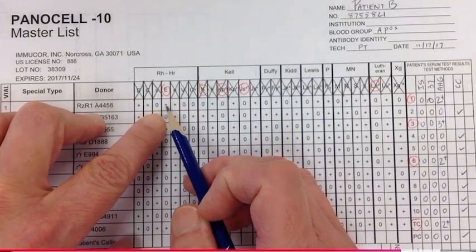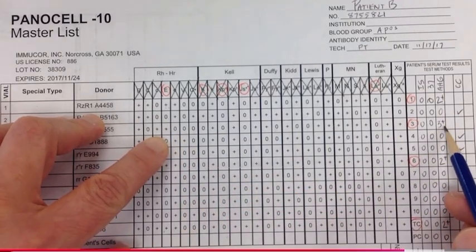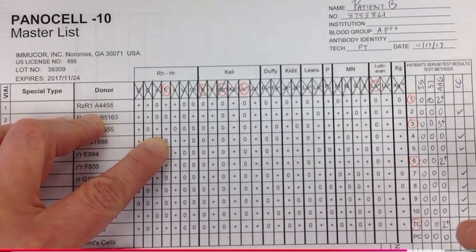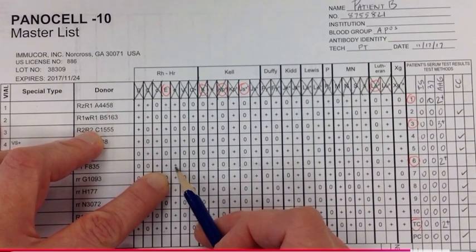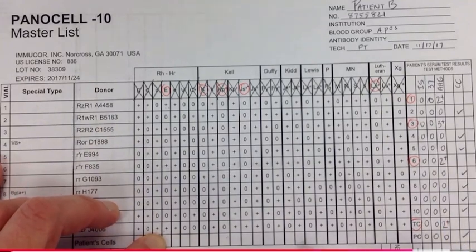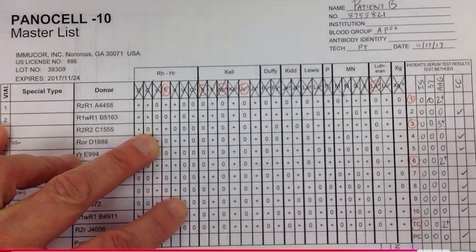All right, now let's see if we can answer the question about why we have different reaction strengths. So big E, okay, so that's heterozygous, so we have 2+. Now here we have homozygous, and we have a 3+, so that kind of makes sense because big E is homozygous, therefore it's going to have a stronger expression in this cell, and that's why we have a 3+. In cell 6 we have heterozygous, so once again we have 2+, and then in TC we also have heterozygous and we have 2+. So that makes sense as far as dosage goes. The only cell that's homozygous is showing a stronger reaction.